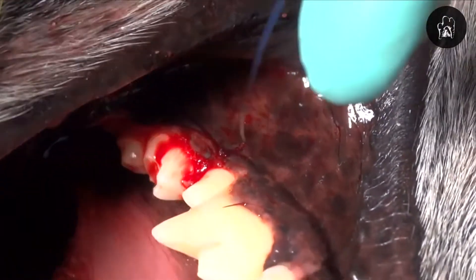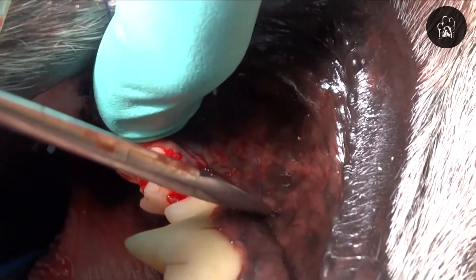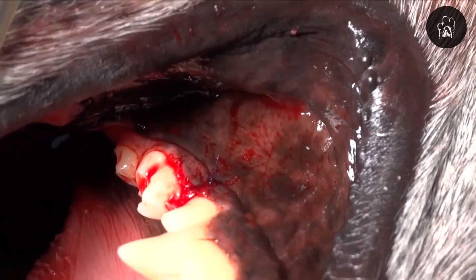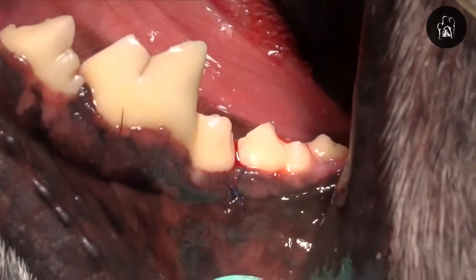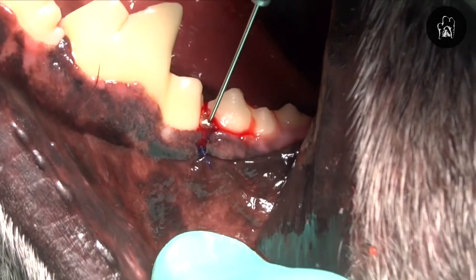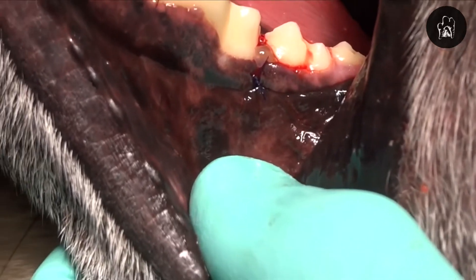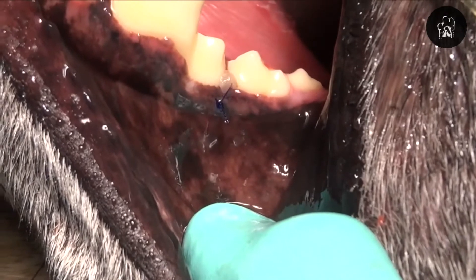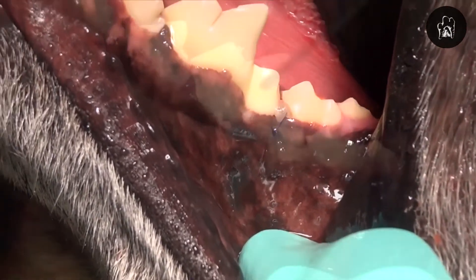Now if we leave that as it is with bone graft there, that's not termed guided tissue regeneration, but we can also use a membrane. In this case we'll use doxyrobe as a physical membrane that will help block the epithelial downgrowth into that defect. So here we're placing doxyrobe into the defect in order to create a solidified material that will actually prevent the gum tissue from growing down into the defect and ruining our outcome. We place the doxyrobe gel and use our air water syringe to harden that partially, and then come back with our periosteal elevator and pack that on top of that bone graft.